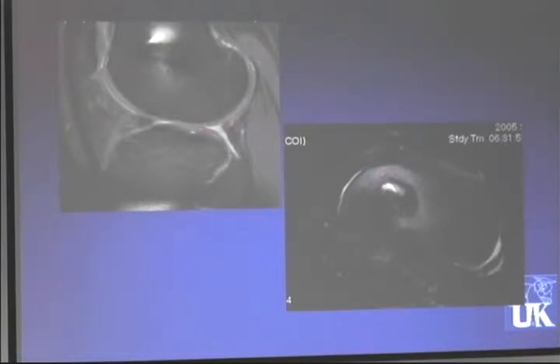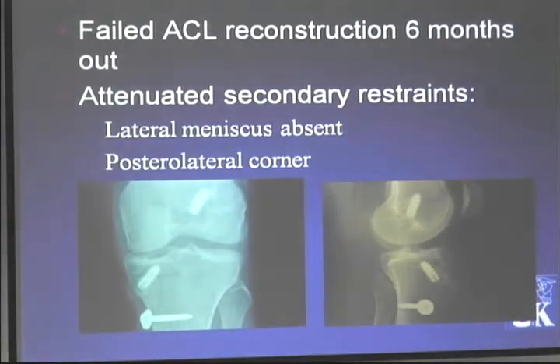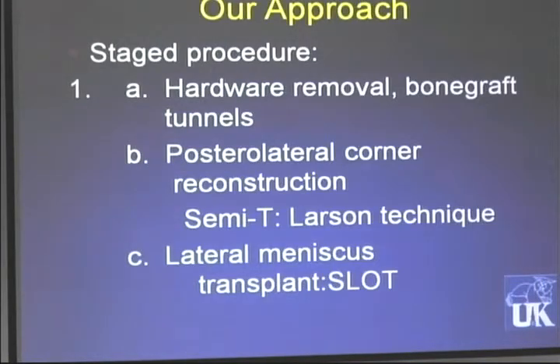Completely absent lateral meniscus, right? We've seen this picture earlier on the MRI talk. No posterior horn. We knew that from before, right? We were staring at the popliteus tendon. Some signal at the posterolateral corner I was concerned about. We're going to talk about anatomic ACL surgery later, but clearly non-anatomic ACL surgery. The ACL graft attaches right here on the femur, so easy to check that radiographically now. But she's got a lateral meniscus absent.